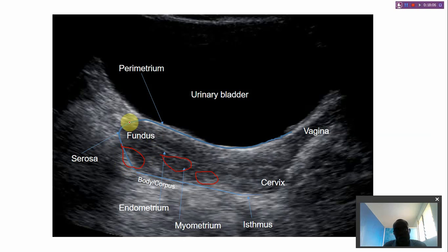The one that develops in the peritoneum connected to the ovary is also a pedunculated fibroid. So fibroids come in various ways, locations and appearances. These are basic nomenclatures or terms used to describe the uterus and where masses normally form.